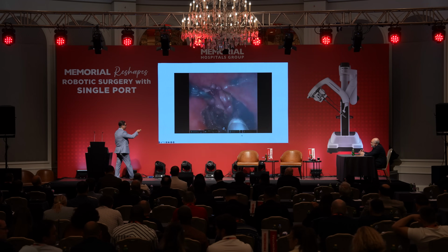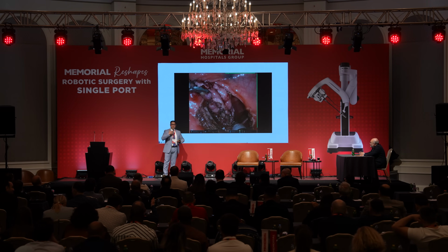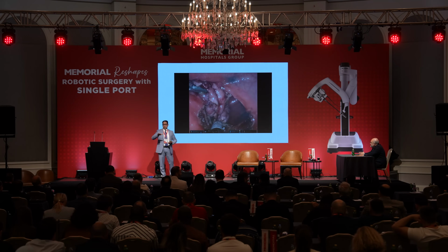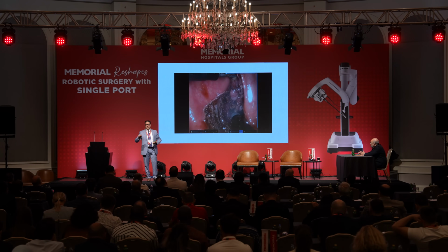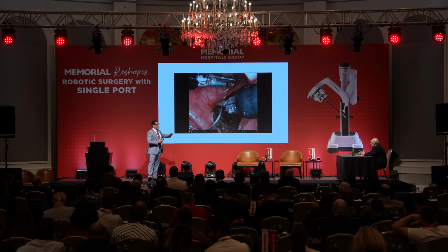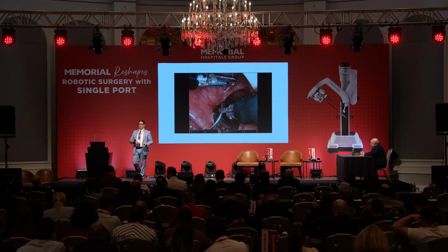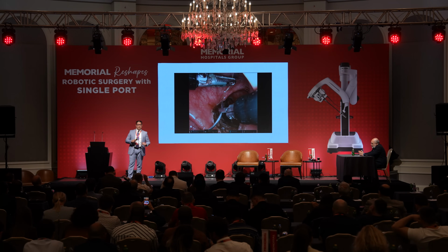You can see the muscle layer. For those of you interested in transanal, sometimes as surgeons we want to do submucosal dissection, and sometimes we want to do muscular dissection. We don't want to get into the mesentery in case that part is T3. But if you have T1 and you took this polyp out, right now, according to NCCN guidelines, done. You just survey the patient. New data are coming for T2s with prognosticating factors. For T2 rectal cancer, you may not need to do low anterior resection. So this is a big era now in colorectal surgery.